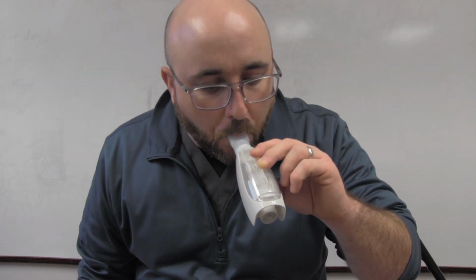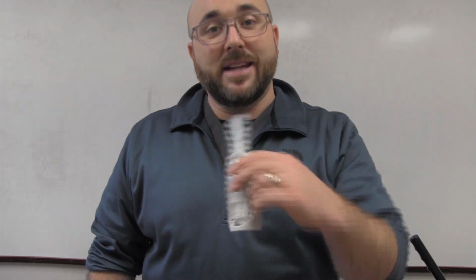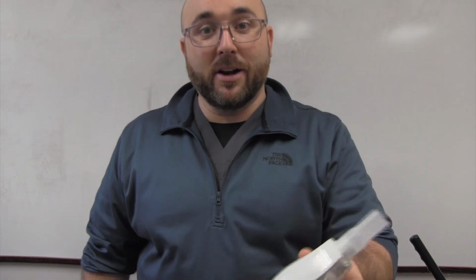It doesn't just magically fly up and come out. If you have pneumonia, it just doesn't magically go away. You have to work at it, and you've got to get your mucus out. This will help you. So we're going to take our breath in. Right there at the end. That was good. Let's say I do 8 more. Here's my 10th.